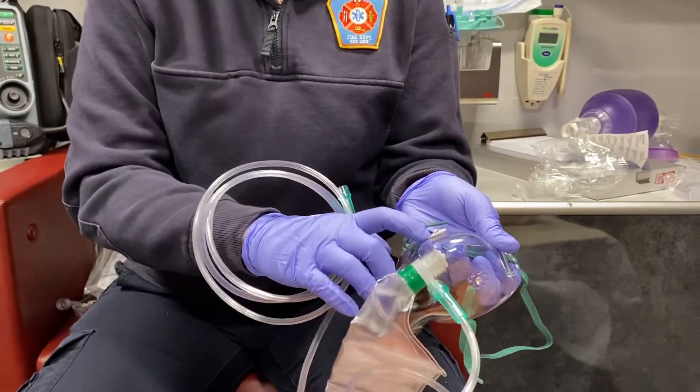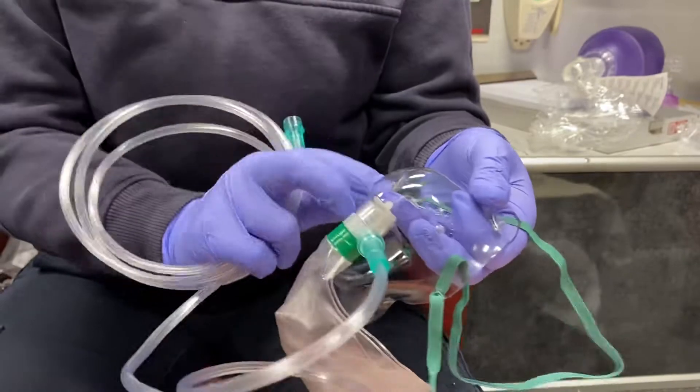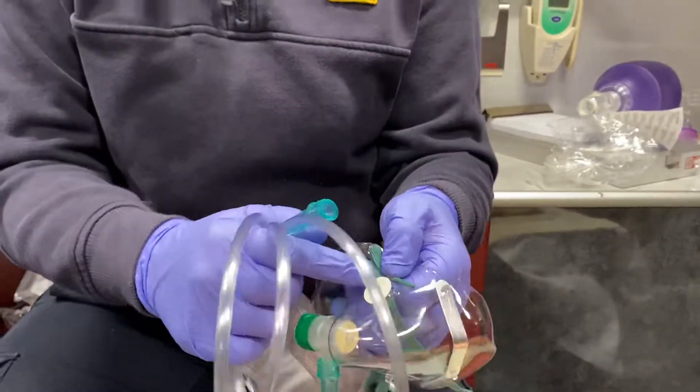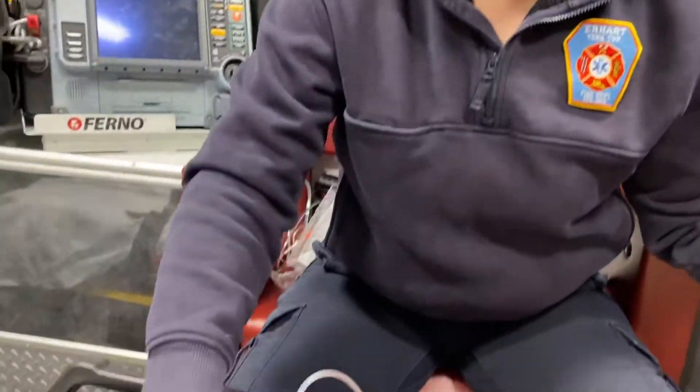You should have the covers on both sides covering the port. One of them fell off as I opened the package, but there should be two covers on those ports, making it a true non-rebreather mask. That just means that the patient can't get any of the ambient air mixing in.